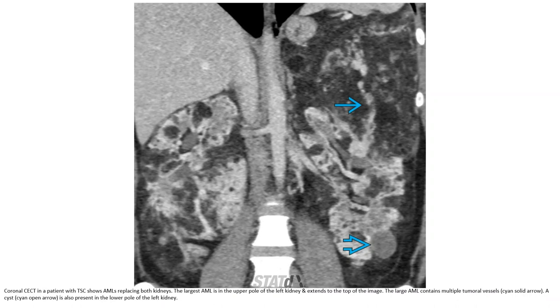Contrast-enhanced CT in a patient with tuberous sclerosis complex shows angiomyolipomas replacing both kidneys. The large angiomyolipoma is in the upper part of the left kidney and extends to the top of the abdomen. It contains multiple tumoral vessels. A cyst is also present in the lower part of the left kidney.